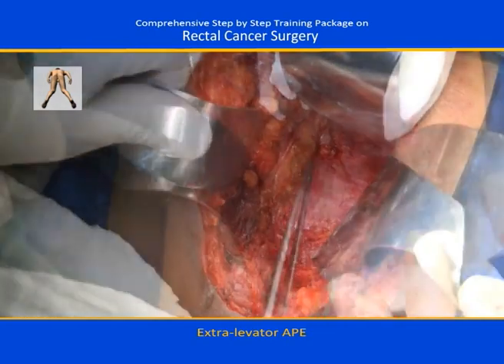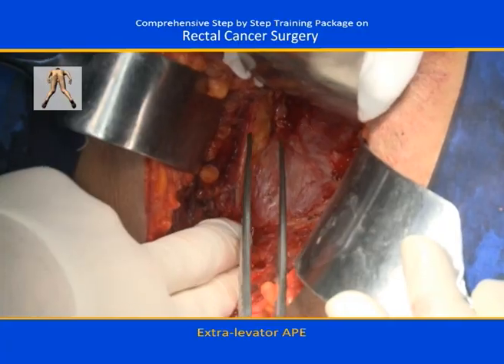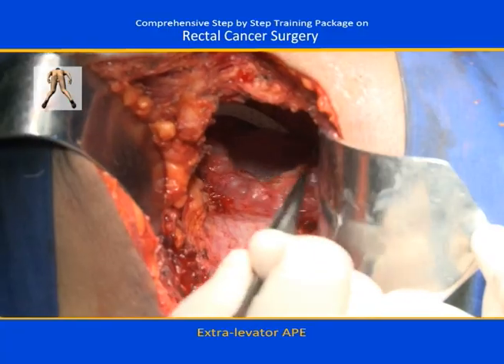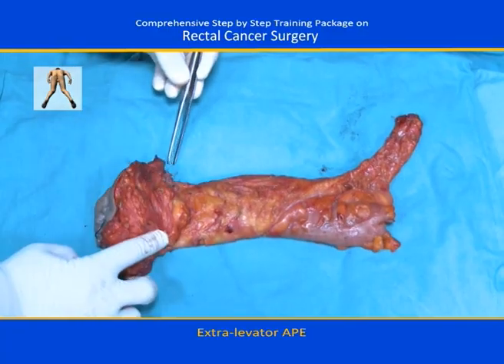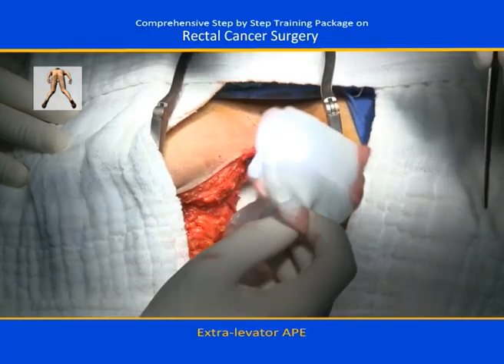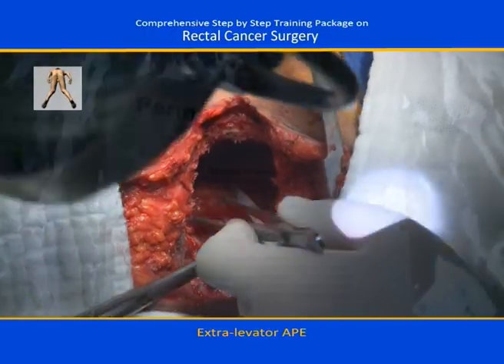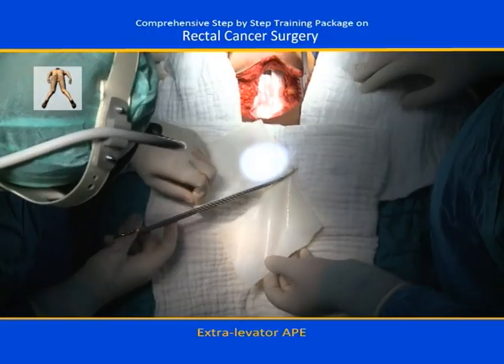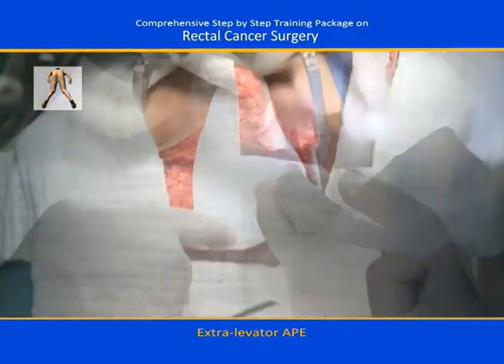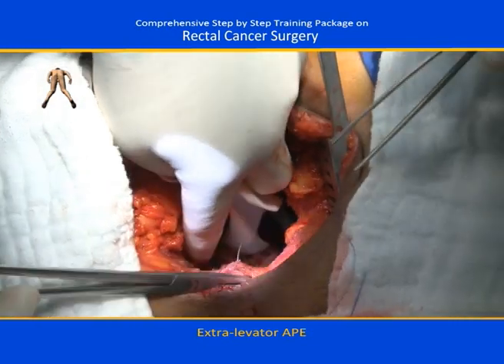Here, we view the nerves once more. Following the removal of the specimen, it is necessary to secure this wide pelvic outlet. Here, the insertion of the Permacol mesh is viewed. Permacol is a biological material, now being stitched to the origin of the levators.